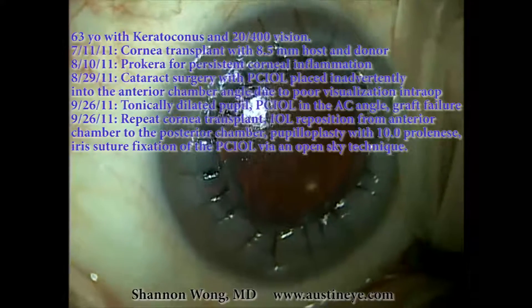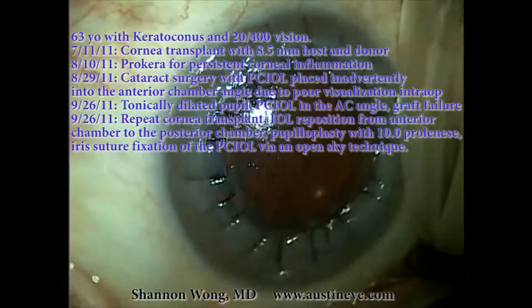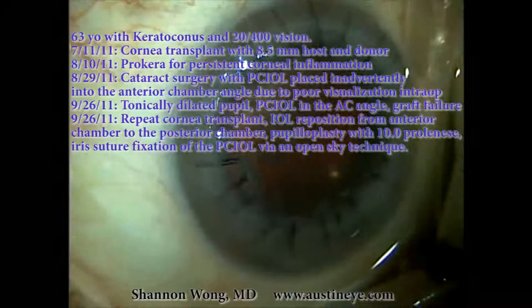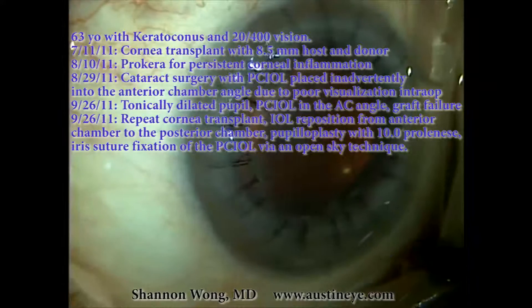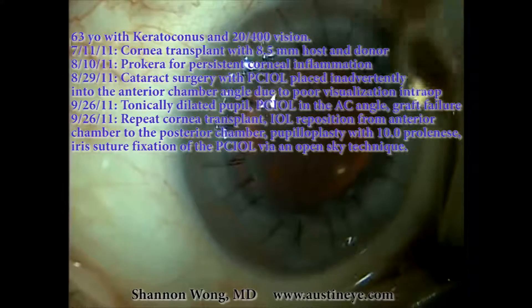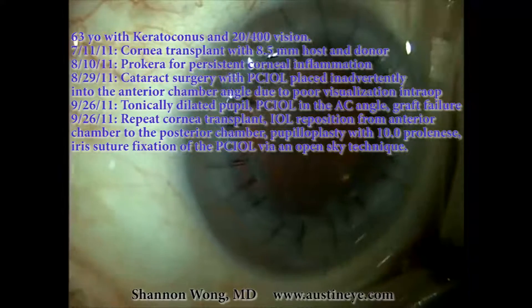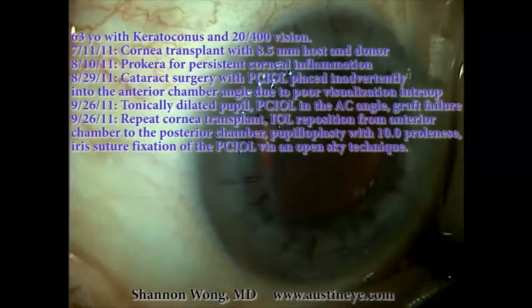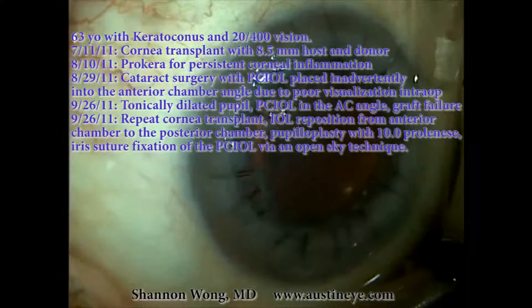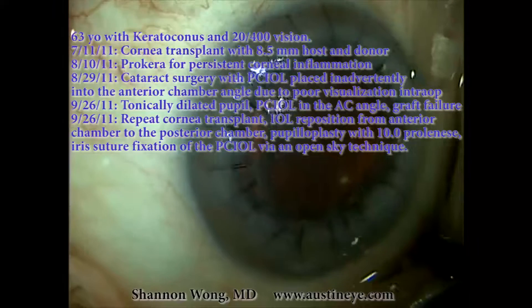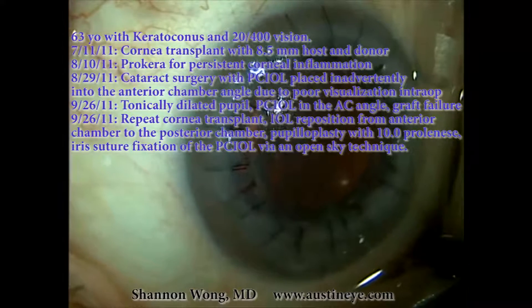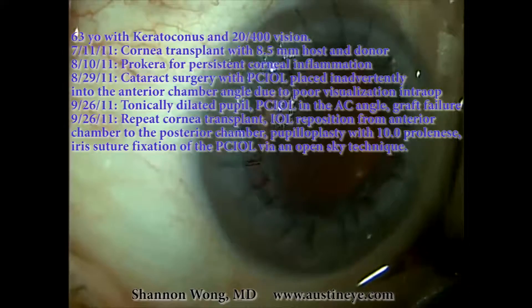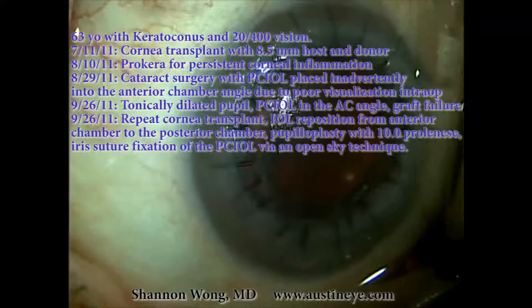This is Dr. Shannon Wong. I'm going to present a case of repeat corneal transplant, where we had to do an open sky intraocular lens reposition and iris pupilloplasty. We also had to do an open sky iris fixation of a posterior chamber intraocular lens.